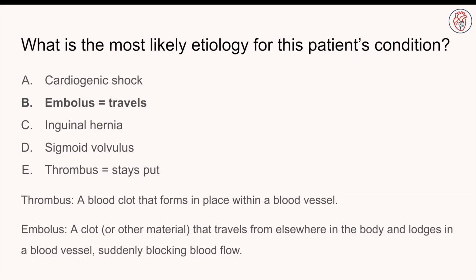And what it means is that our flow is not synchronized. We don't have this beautiful contraction of the atria pushing the blood all at once into a ventricle, and then the ventricle is allowed to push that to the body. And so what happens when our electrical signal, which represents mechanical events, is not in one good unison, well-oiled machine, is that we don't have good blood flow. And what do we know happens when blood stays put? It clots. Here with this gentleman, we've got this dysynchronous, chaotic energy, this fibrillation going on in the atria. So we get this pooling of blood that's not moving anywhere.